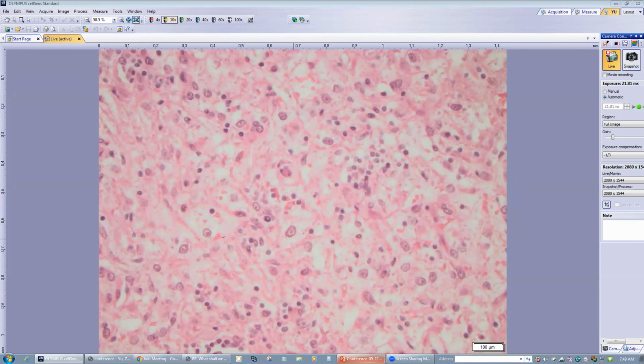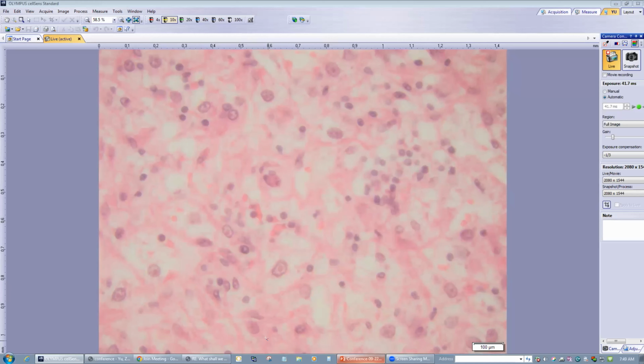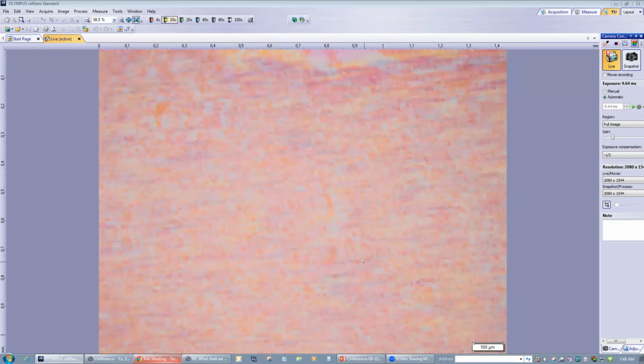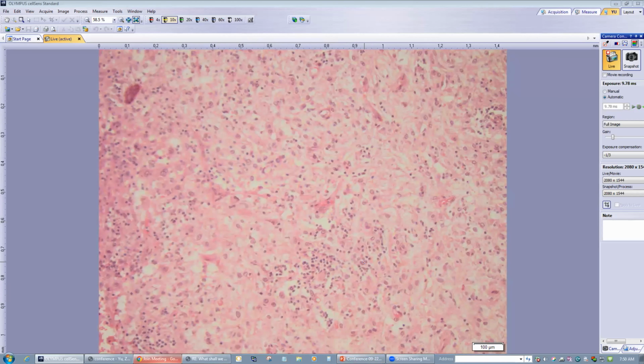You see this here? We call these cherry red nucleoli, and a clear cytoplasmic membrane. It looks kind of carcinoma-looking, like our classic clear cell carcinoma of the kidney.